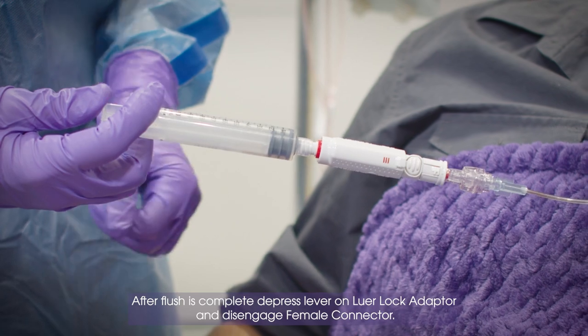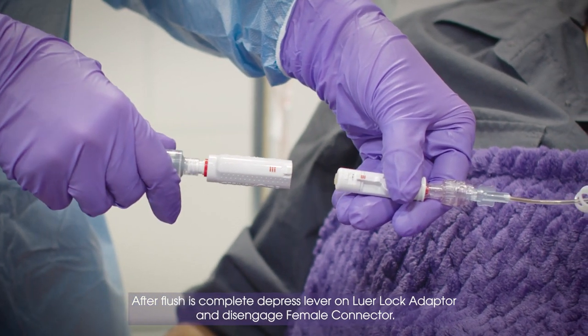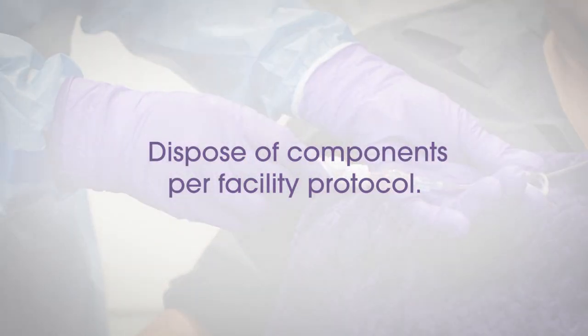After flush is complete, depress lever on Luer Lock Adapter and disengage female connector. Dispose of components per facility protocol.